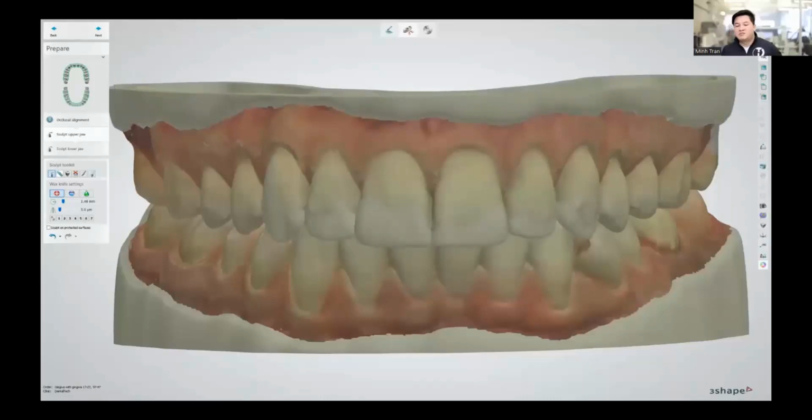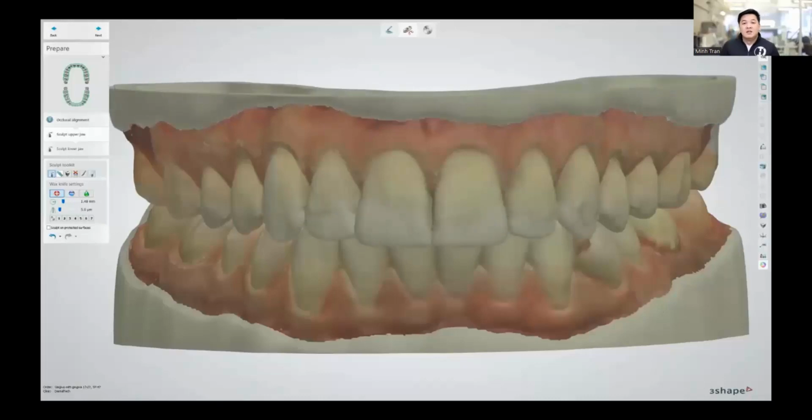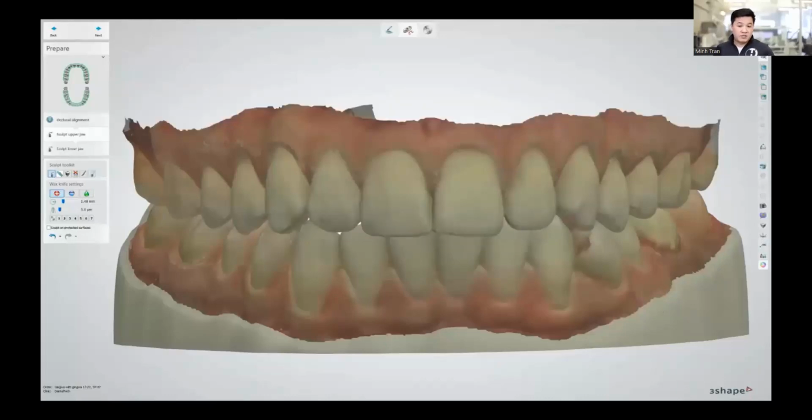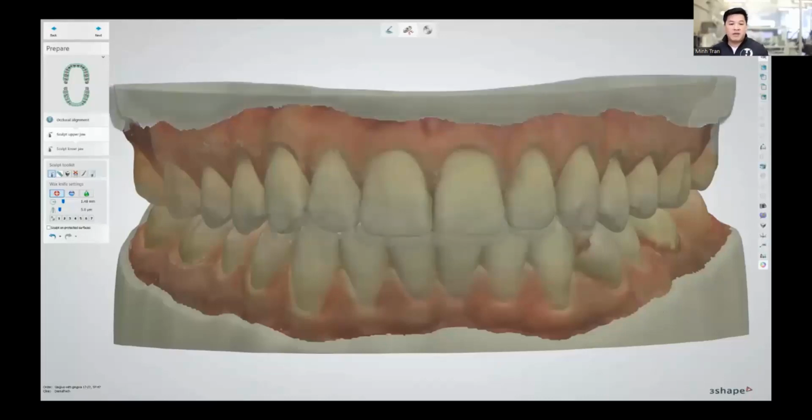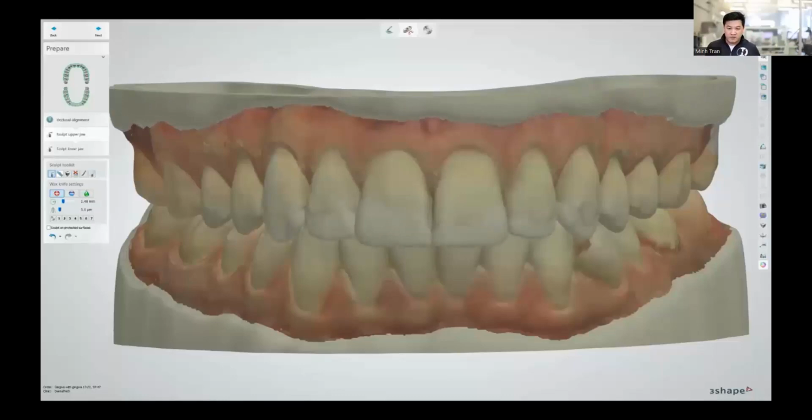And also, I'm able to steal these libraries from all these great technicians that I have really no business pretending to be as good as, right? So I'm using a Nondas library, a Leacoff library, whoever's library. My results that match this specific patient are much better than what I can produce by hand. So again, we can overlay some pictures with that 2D smile design. We merge it all together. The patient's already approved the smile design. We try to get our 3D diagnostic as close as we can to what the patient's already approved.